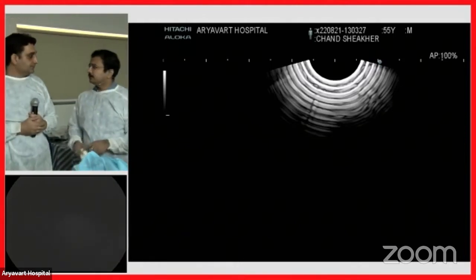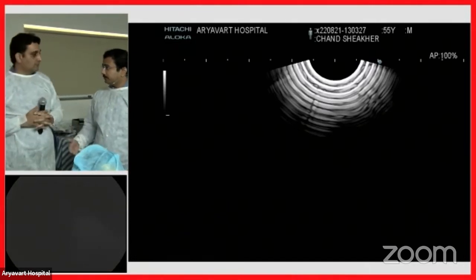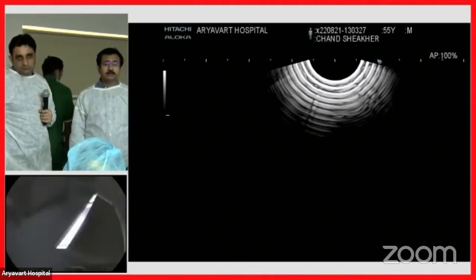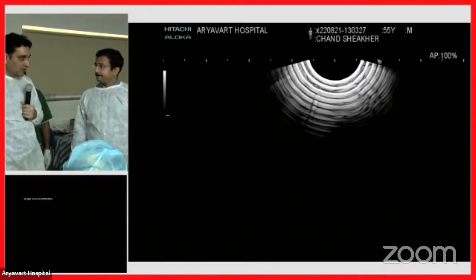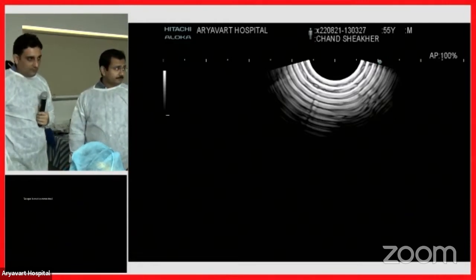One procedure compared to four or five even in large varices. We recommend it for large varices — not for small varices. For any F2 or F3 large varix visible on endoscopy, it is better to do the US assessment because US gives a much better idea of varix size and the collaterals present. Any varix more than 10 mm, we call it large, and that is what we consider for this approach.